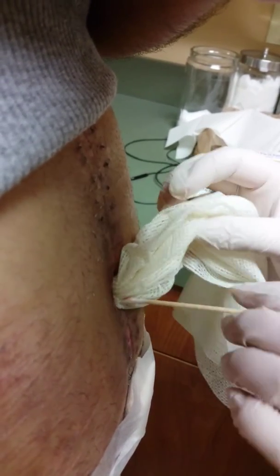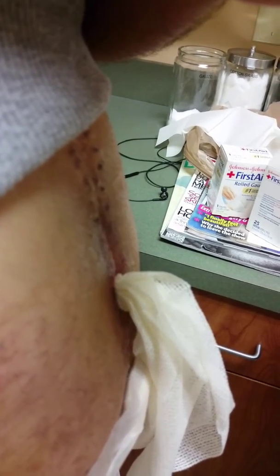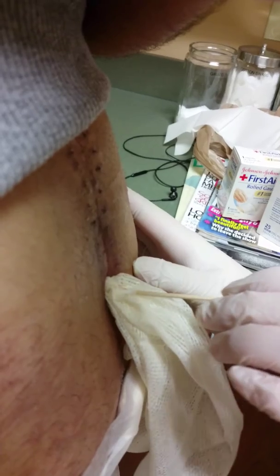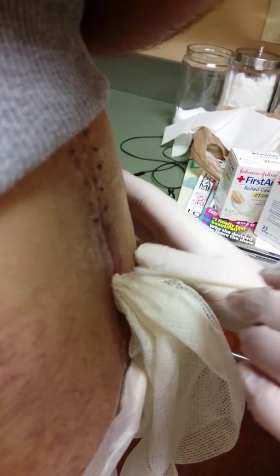And this is thicker. You also don't want to put too much in because it's just going to create too much pressure and be uncomfortable. You don't need a lot of force for this — just very gentle.